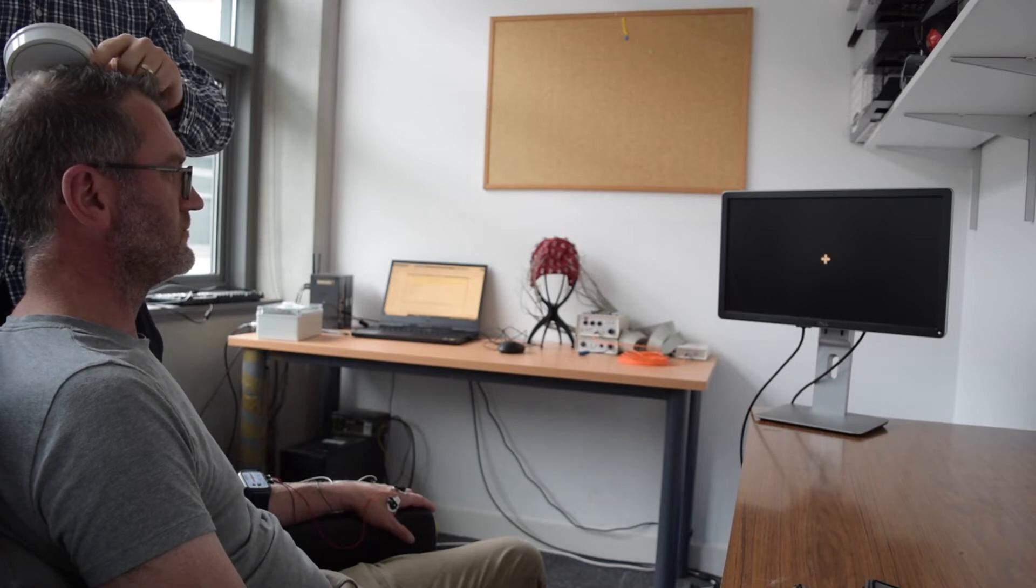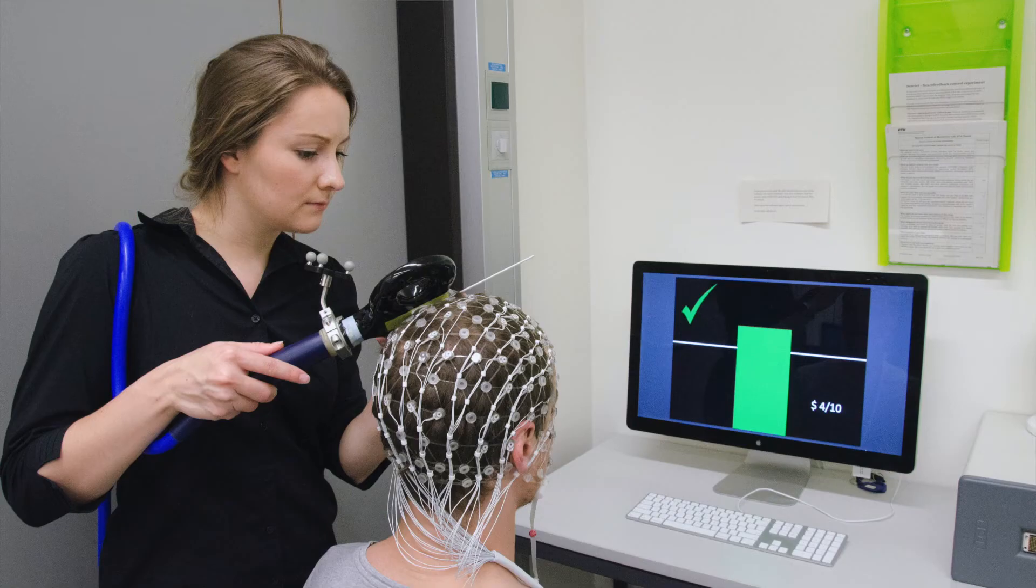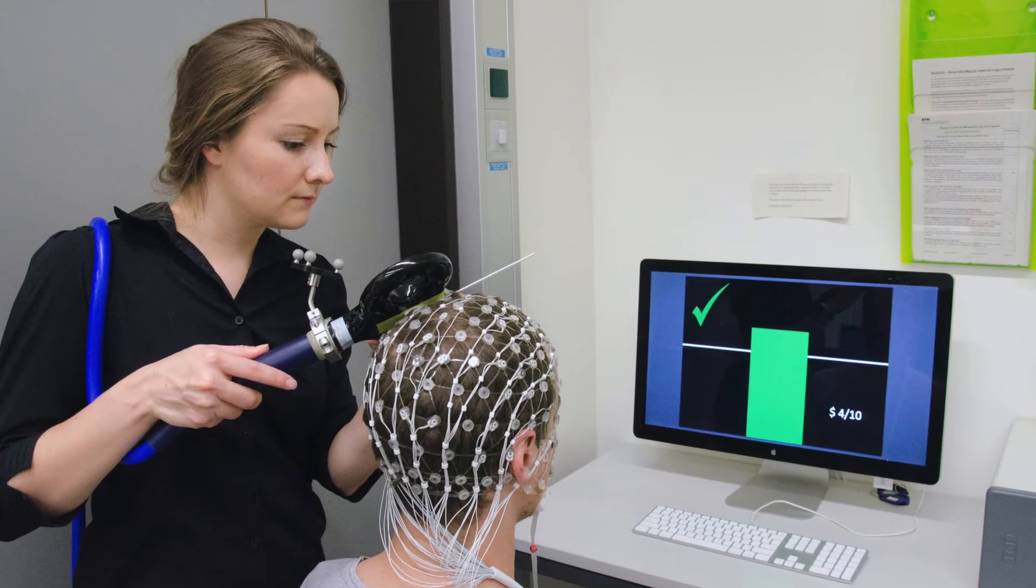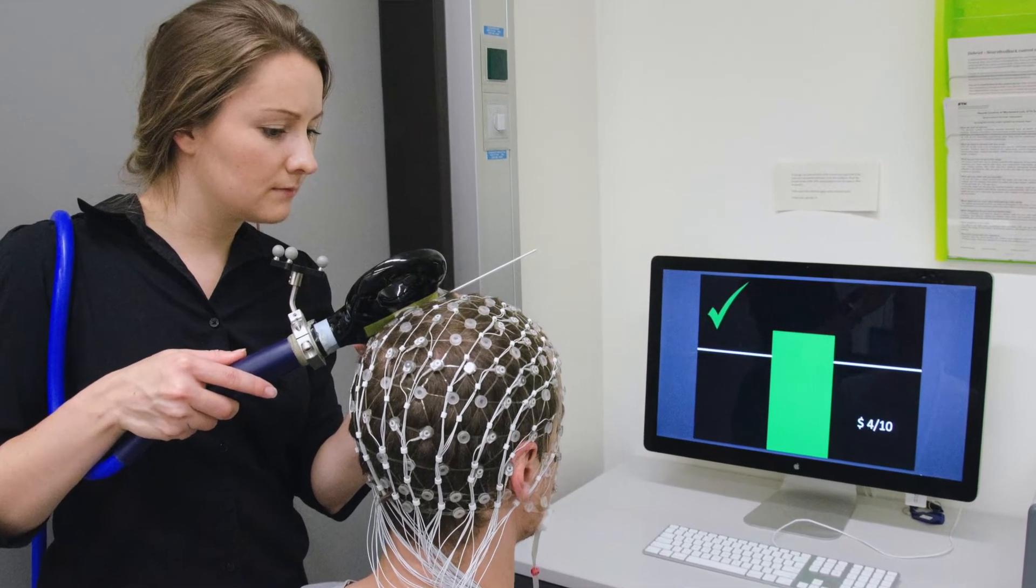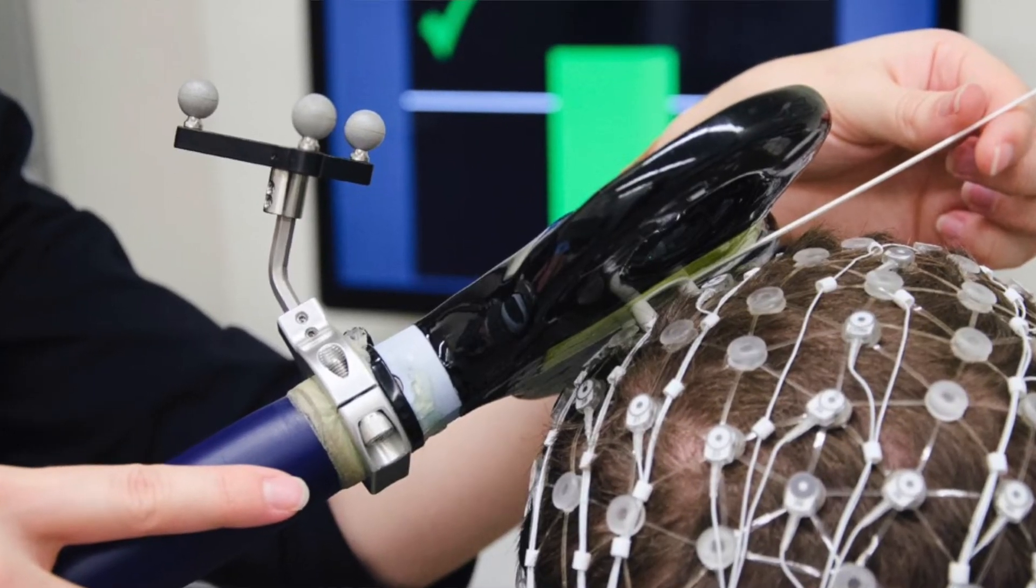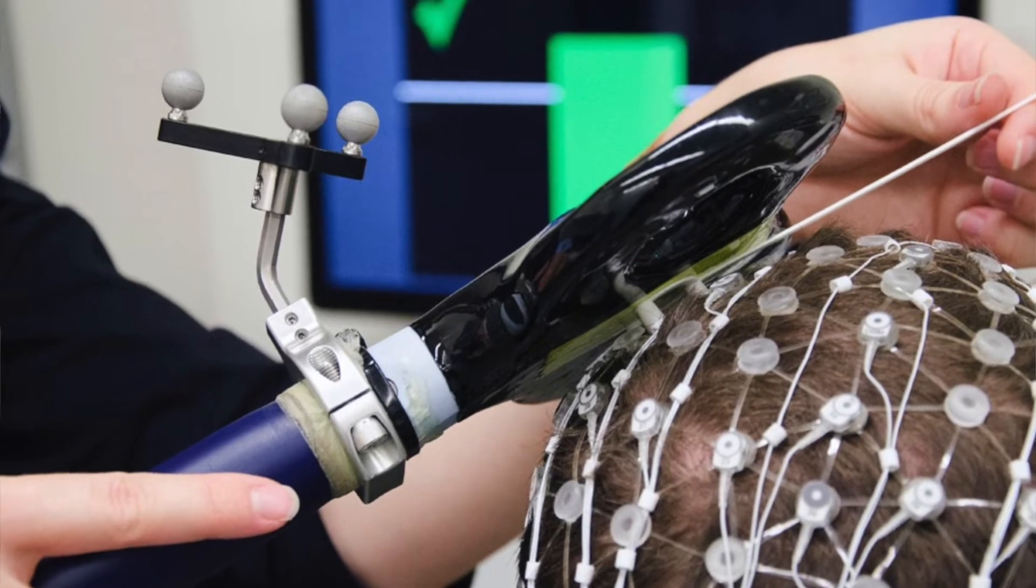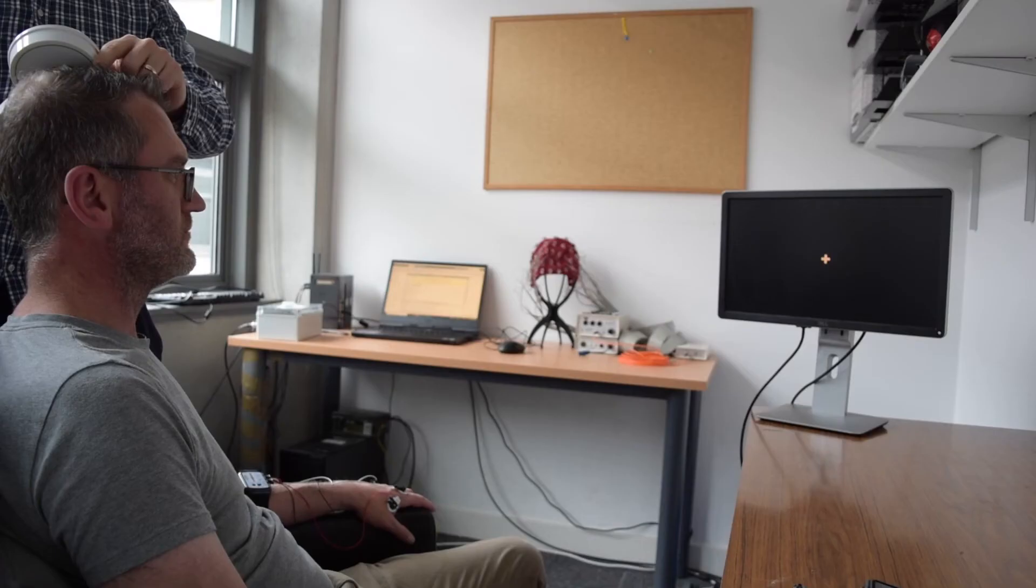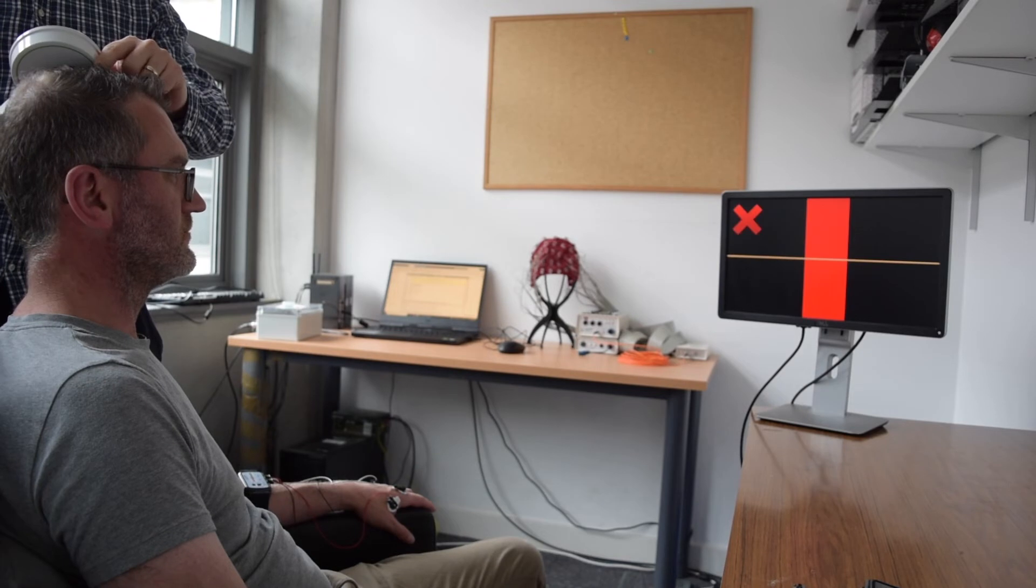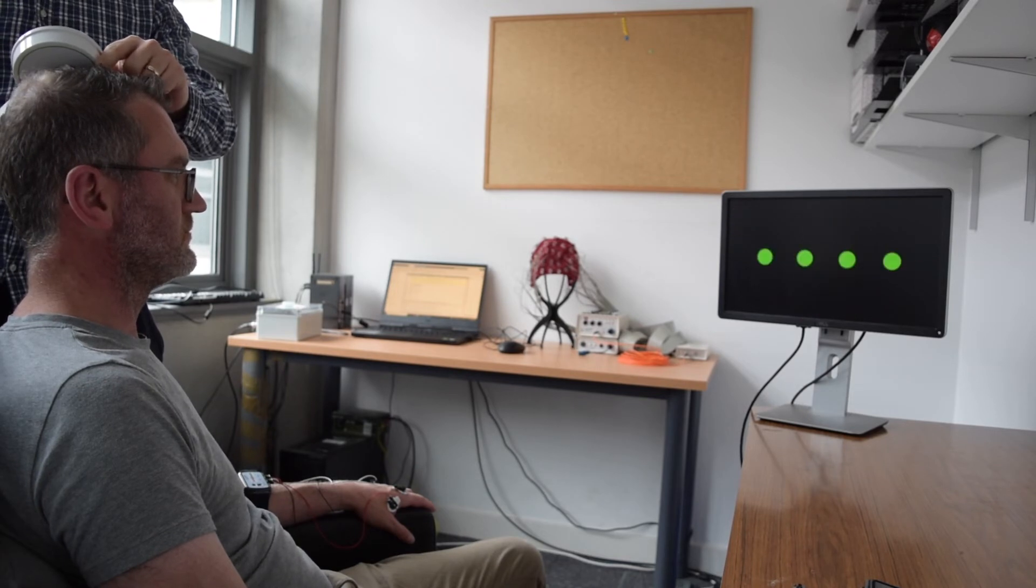If we are training the participants to make their MEPs larger, they need to engage their mental imagery strategy to get the bar across the line representing their baseline amplitude. If it is large enough the trial is a success, the bar is green and a positive sound bite is heard. If not, the bar is red and a negative sound is heard.